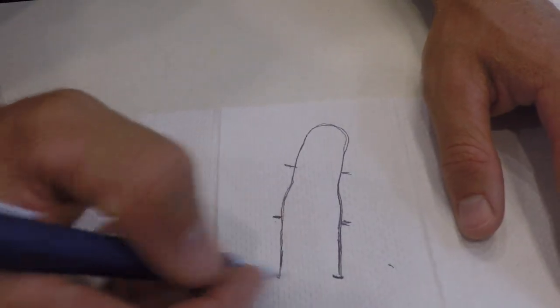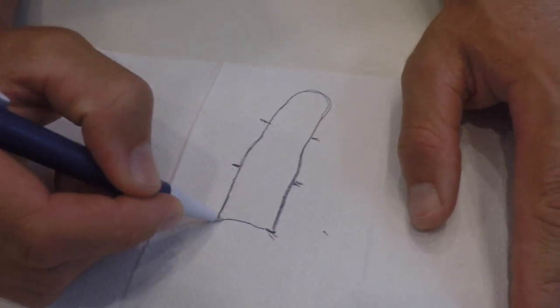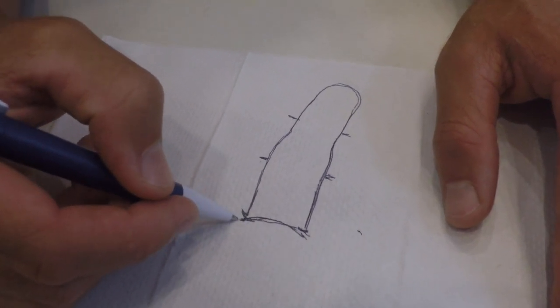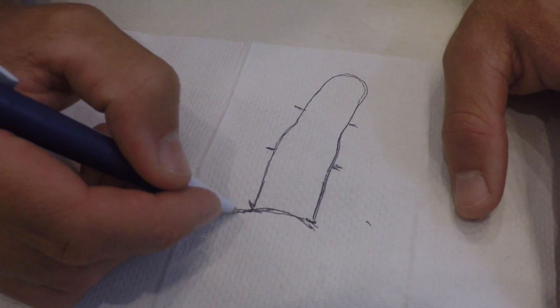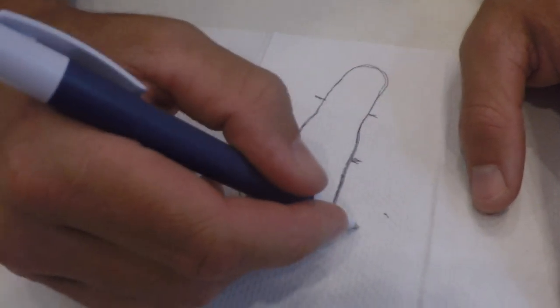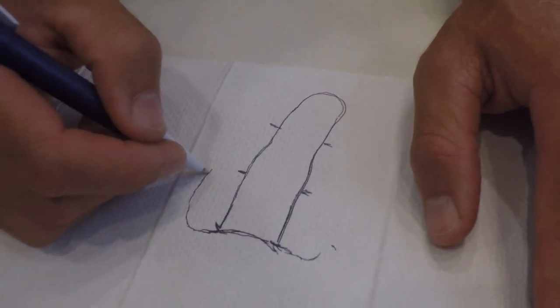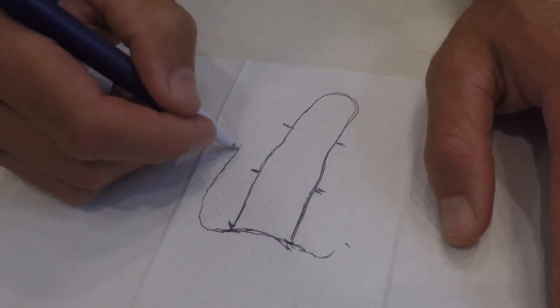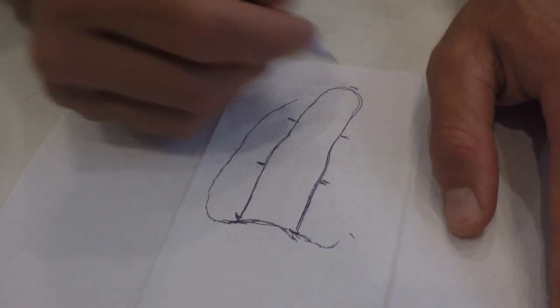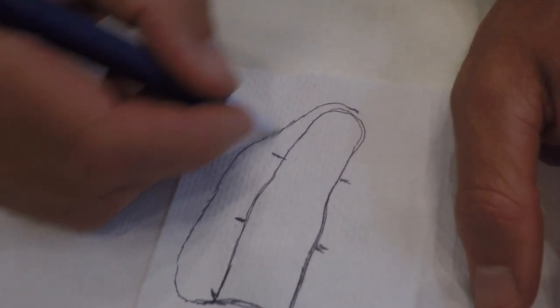The proximal portion of the splint you want to kind of curve up. You want to bring it out and be pretty generous with the amount of space on either side of the splint. This is going to be the gutter portion — it goes up, and by the time you get to the top it's just right next to the finger.